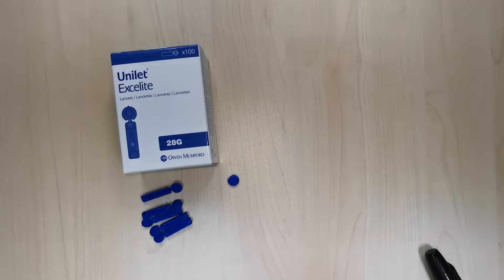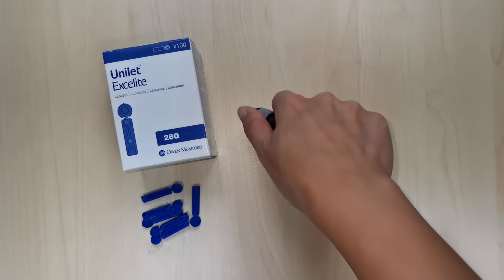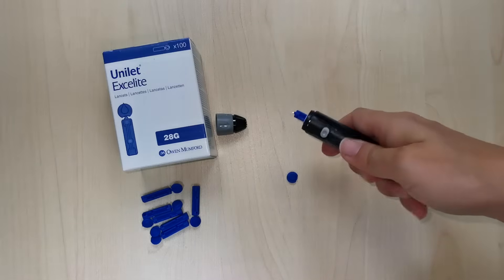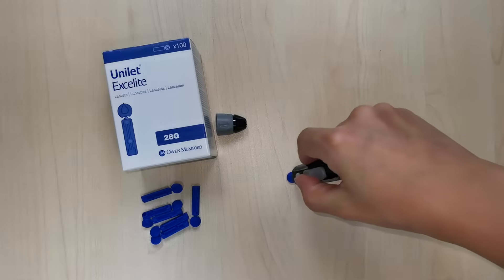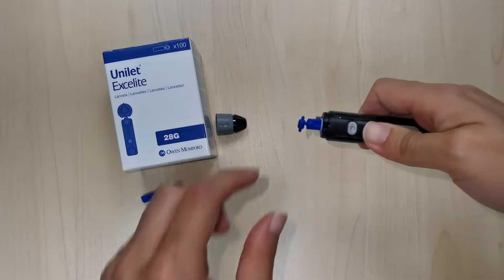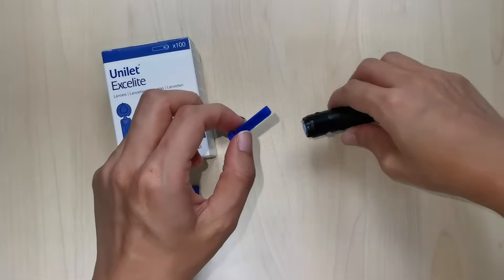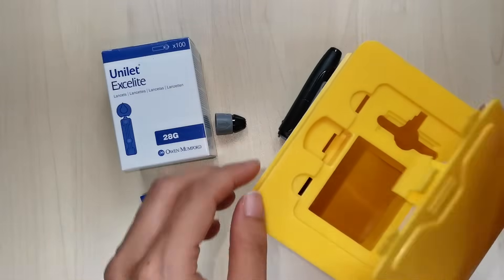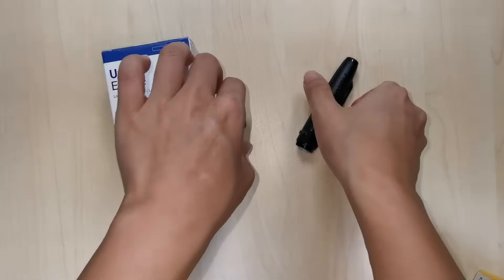To release the used lancet, first remove the lancing device cap and then push the lancet release slider forward or downward. If the lancet doesn't detach, push the slider forward and carefully put the cap onto the needle, then with your fingers pull the lancet away from the device. Finally, the lancet should be removed and disposed of in a sharps container to prevent needle stick injuries.